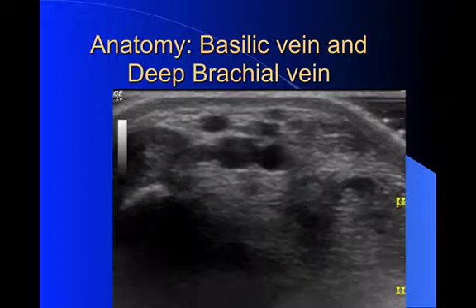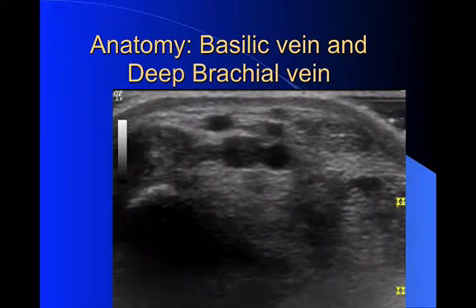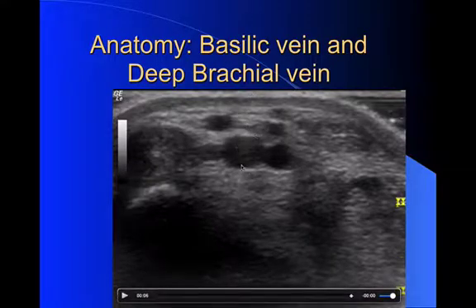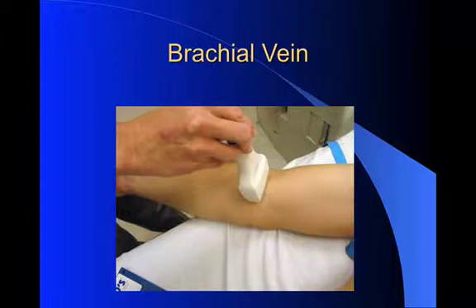And what you do for this technique is you really set the probe to 2 centimeters or the least depth possible. The next thing you do is you hold the probe at the neck of the probe to apply minimum pressure on the skin as you place the probe over the vessel. Here you see artery, here you see vein and vein. This is where you place the probe on the arm. Again, you're going to use minimal pressure, and you're actually going to hold the probe down further towards the neck of it. This probe is being held this way just so you can get a good picture of where it should be.